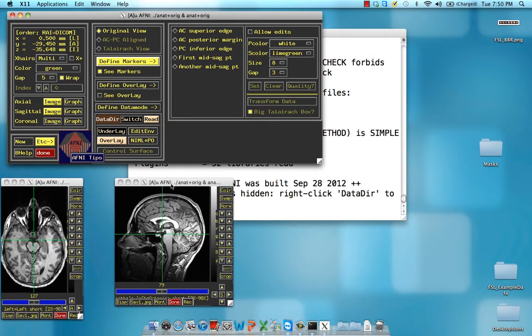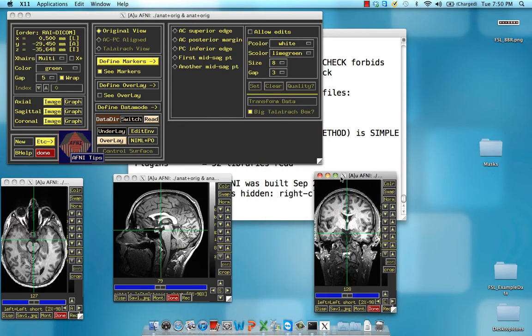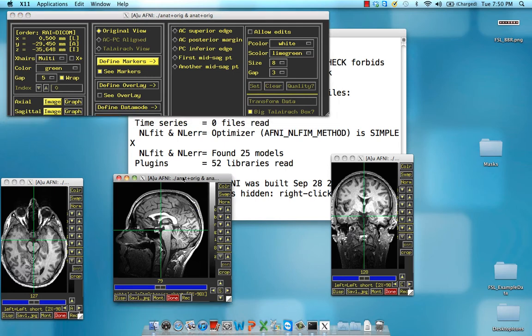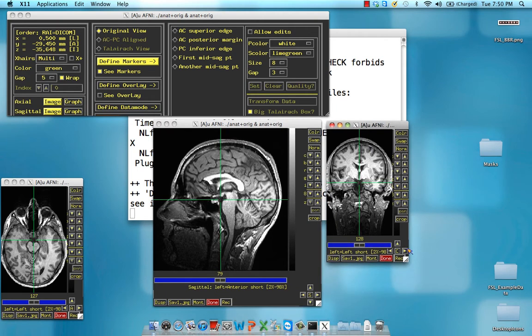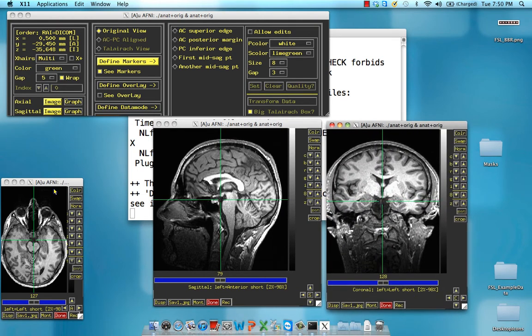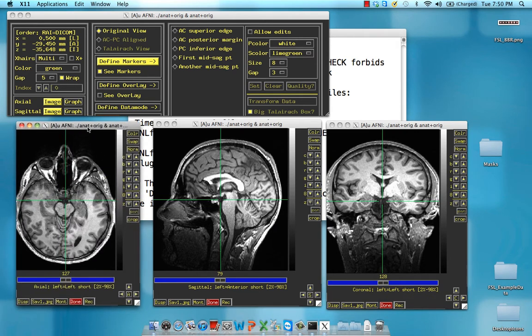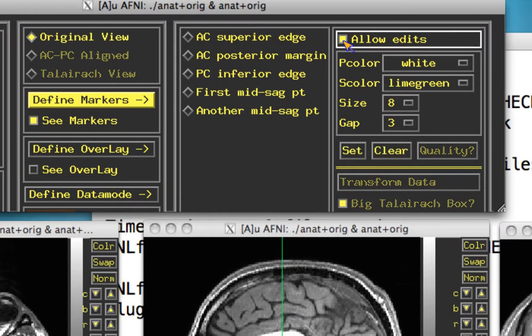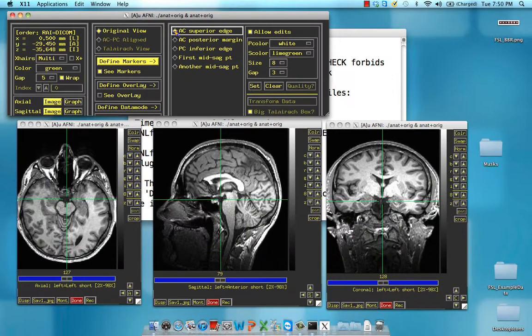Once we have that, resize all of the axial, sagittal, and coronal panes to make them a little bit bigger. Once you're satisfied, go ahead and click on Allow Edits. Then click on AC Superior Edge. We're now going to be marking certain parts of the brain so that we can warp it to Talairach space.